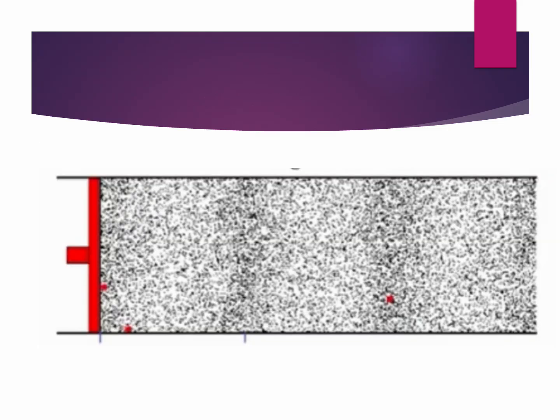This is a visualization of a longitudinal compression rarefaction wave in slow motion. A compression zone is quickly identified because when the particles are compressed they form a dark area, and the rarefaction zones are recognized as the lightest zones due to the low density of particles.